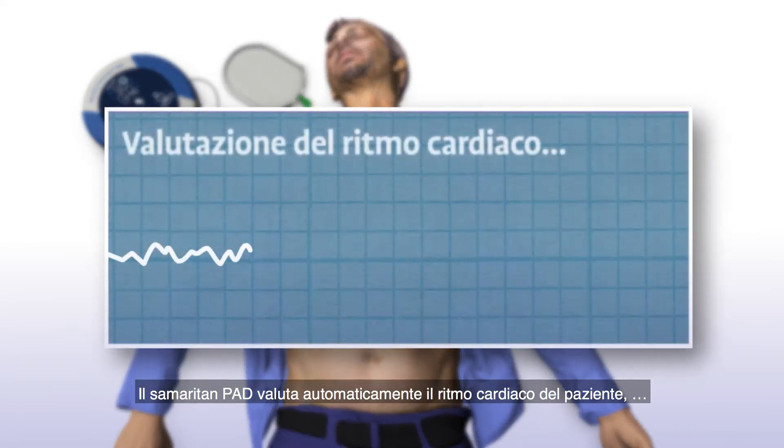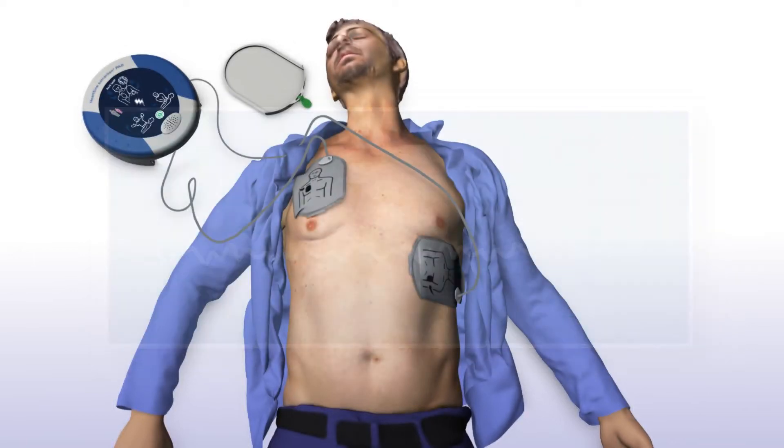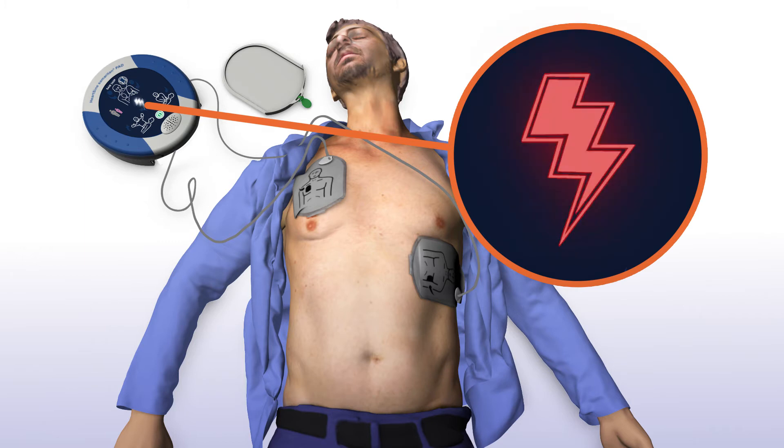The Samaritan PAD automatically assesses the patient's heart rhythm. The device prompts: "Valutazione del ritmo cardiaco. Non toccare il paziente." And will automatically deliver a shock if needed. The device announces: "Allontanarsi dal paziente. Shock consigliato. Allontanarsi dal paziente." Then counts down: 3, 2, 1.